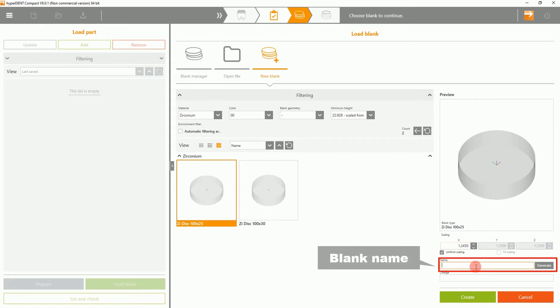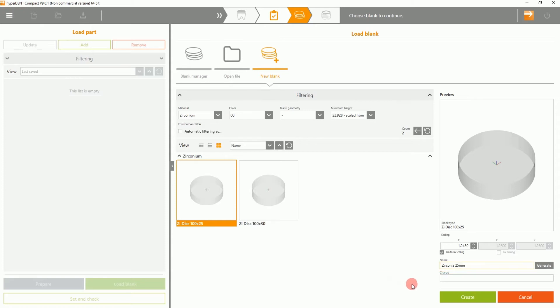Underneath, you can see the blank name, where you can change the blank name to whichever you prefer. In this case, we will be naming this blank Zirconia 25mm.